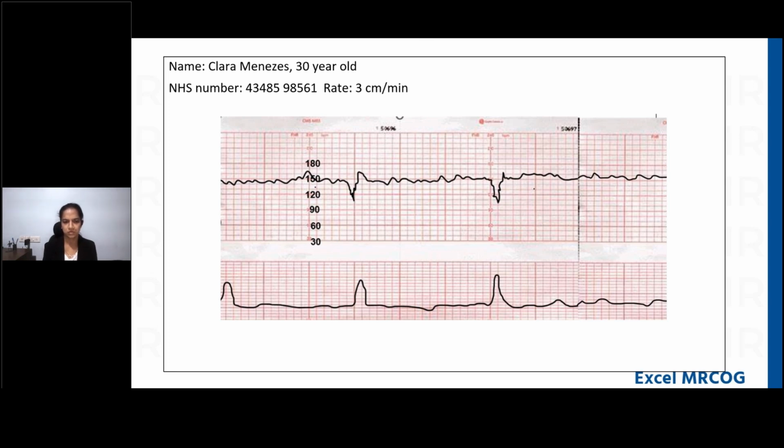What was the CTG at that time? You remember? This was the tracing. Okay, this one. So with the significant meconium alone, in that case, it is not of significance. Defined risk means the patient is having any other underlying comorbidities like raised BP with IUGR, and with meconium, it is significant meconium, that is the defined risk.